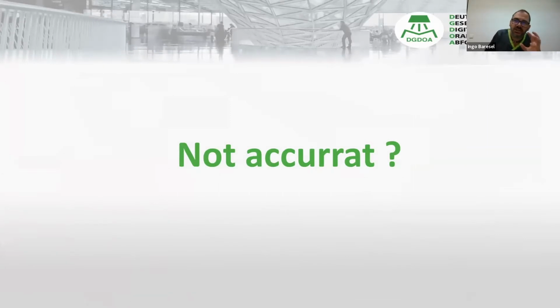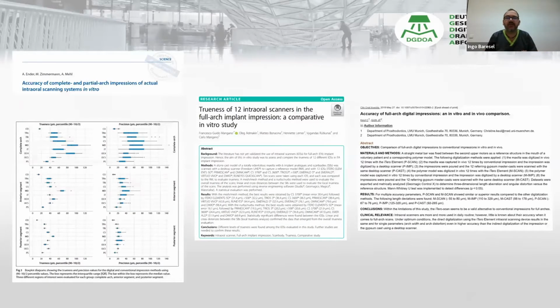But the main question always is, is scanning really accurate? And I can tell you, yes, it is accurate. Look at these studies. On the left side, you see a study of Professor Mehl from the University of Zurich, which says nearly every scanner which is on the market now, and we talk now about full arch scanning. We don't talk about single teeth. We talk about full arches. And this was always a problem in scanning in former times.